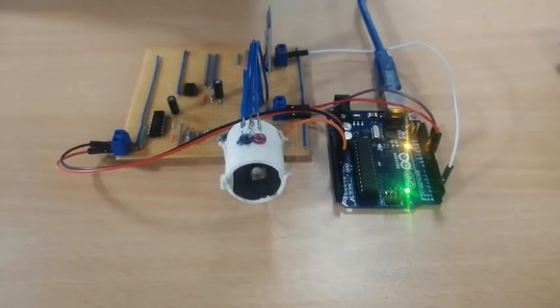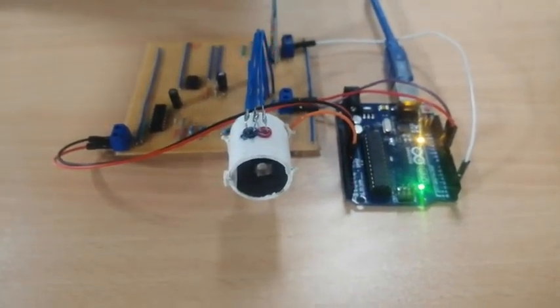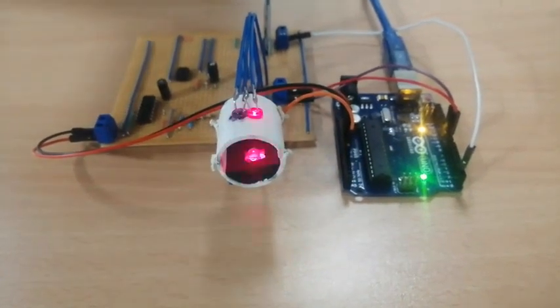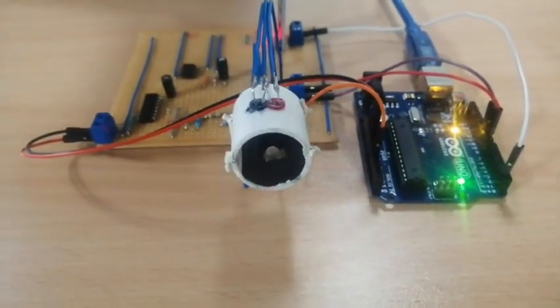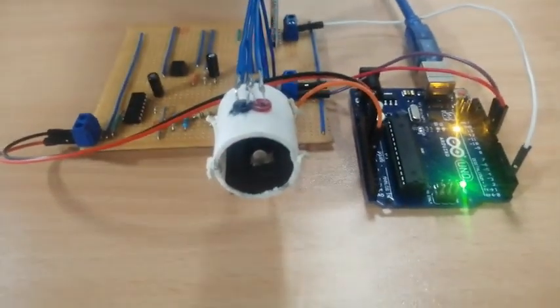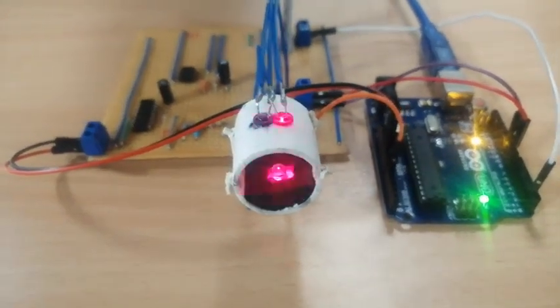So the white PVC pipe is the finger clipper. It contains two LEDs, red and infrared, that transmit light through the finger. On the other side, we have a photodiode which detects the amount of light that went through the finger. The black foam is for blocking ambient light and also providing comfort to the finger.